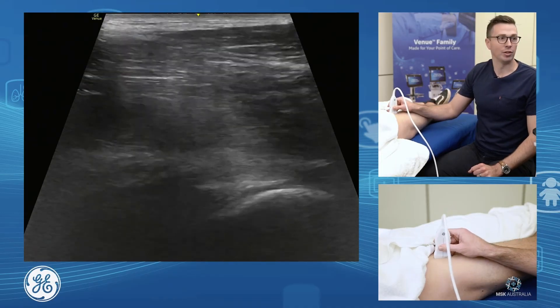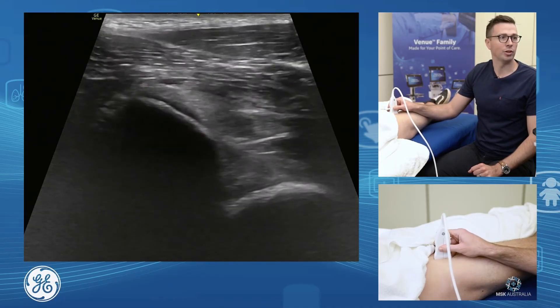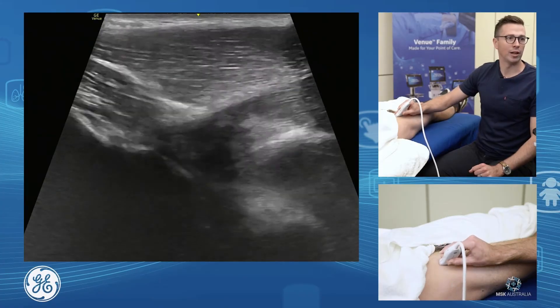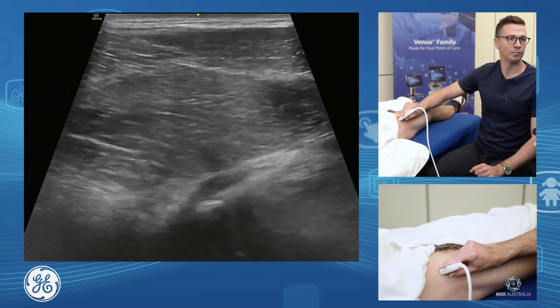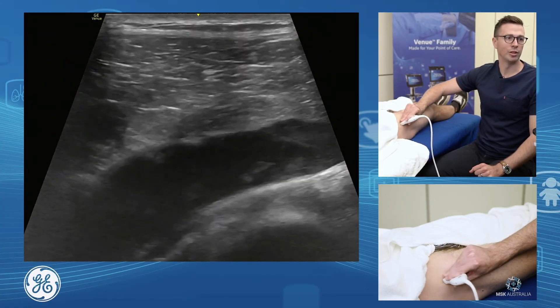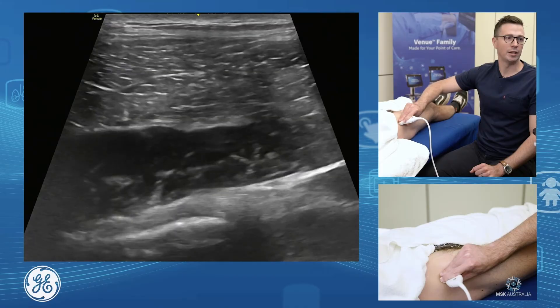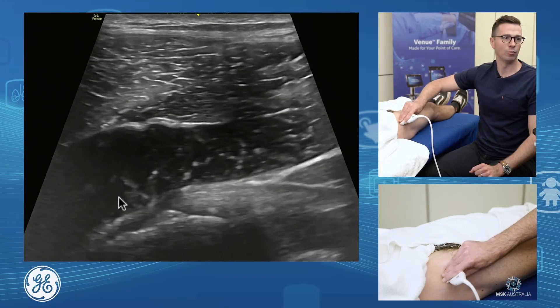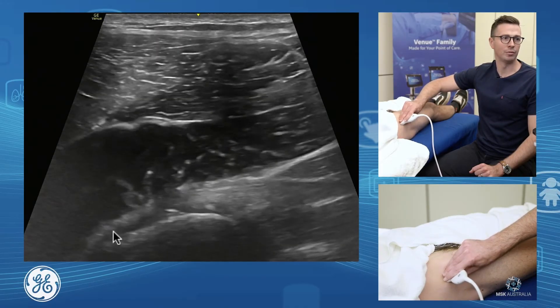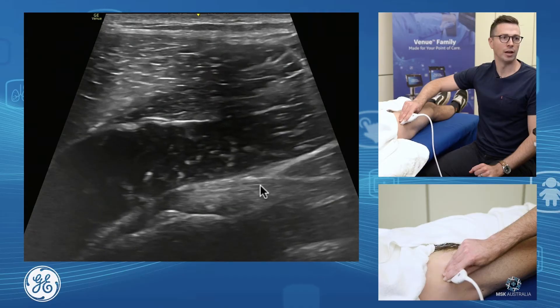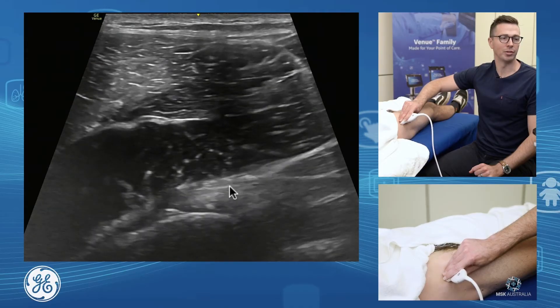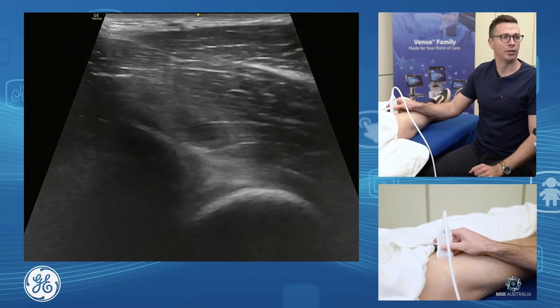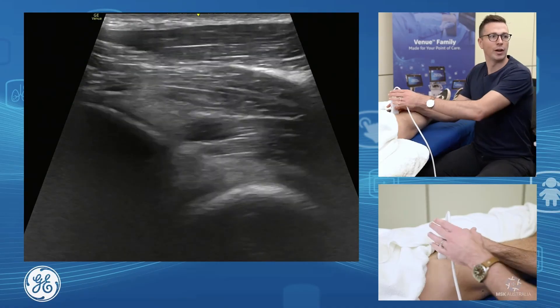To identify our indirect head, from this view we bring our probe around laterally from a very lateral approach. Here is our indirect head of rectus femoris running out and along into its musculature, back up in through here. So that's one way of getting to rectus femoris.